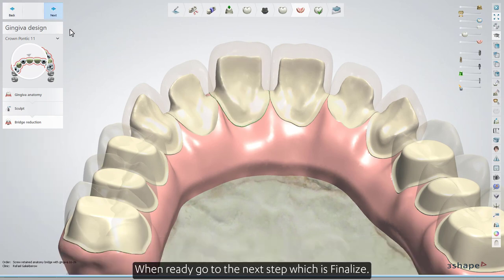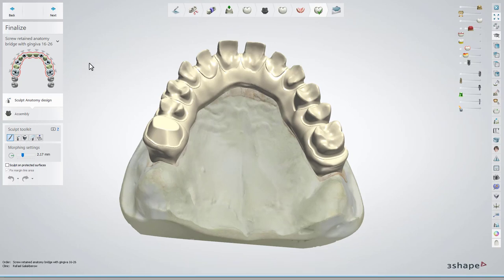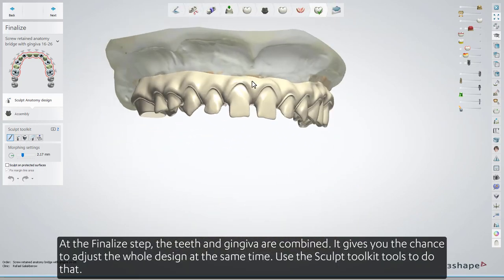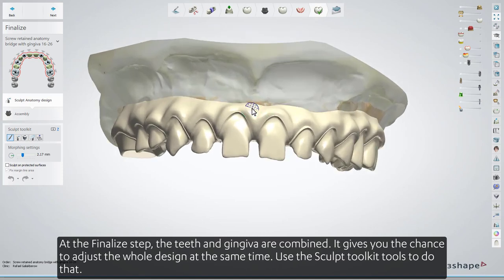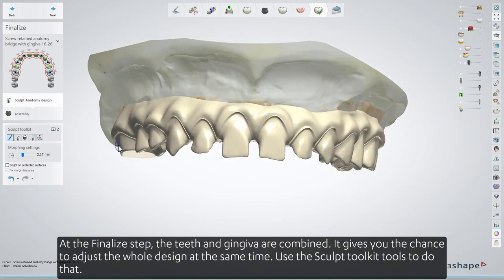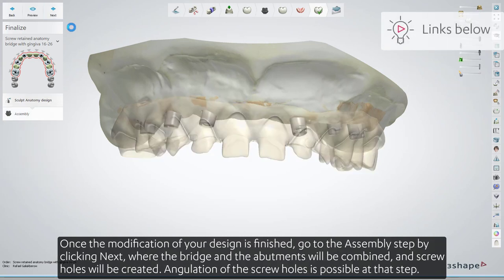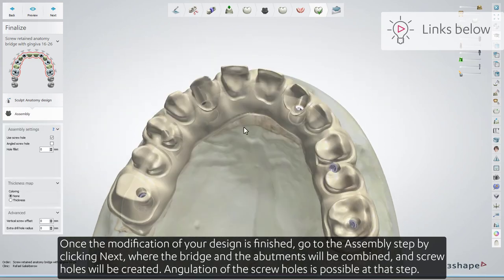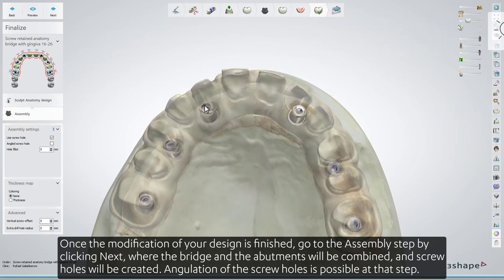When ready, go to the next step, which is Finalize. At the Finalize step, the teeth and gingiva are combined, giving you the chance to adjust the whole design at the same time. Use the Sculpt Toolkit tools to do that. Once the modification of your design is finished, go to the Assembly step by clicking Next, where the bridge and the abutments will be combined and screw holes will be created.